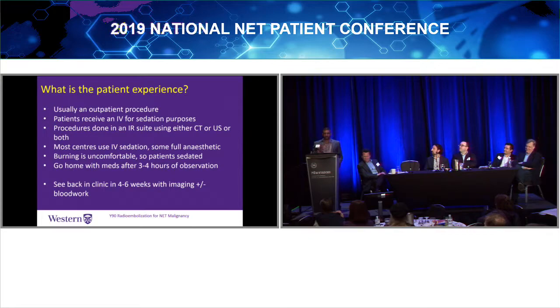Okay, it typically just looks like a white ball of gas that forms around the tumor. It's not predictive, but it's helpful for us when we're treating to ensure that we're dead center in the tumor and that we've planned the geometry of the treatment. That's typically our skill as an interventional radiologist, to target that tumor precisely so that we can burn it completely.